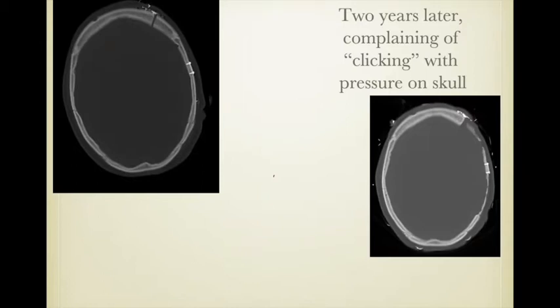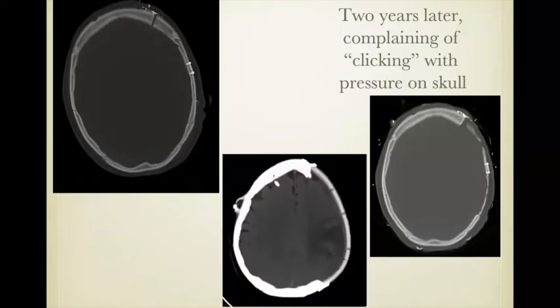And for those of you that drink soda in a can, it's the same idea. Some people call it tin canning, although they're not made of tin anymore. But this idea that the skull is so thin that it moves and will create this clicking noise. The treatment of this, and this is not considered a substantial risk to the patient, but certainly can be problematic, is to replace the patient's native craniotomy flap with a synthetic flap. You notice these holes through the flap. This is now called a cranioplasty.